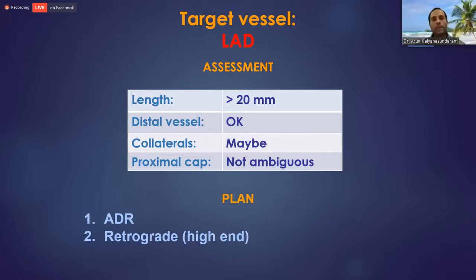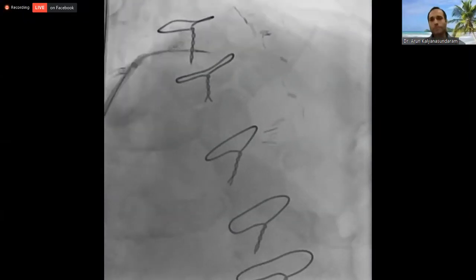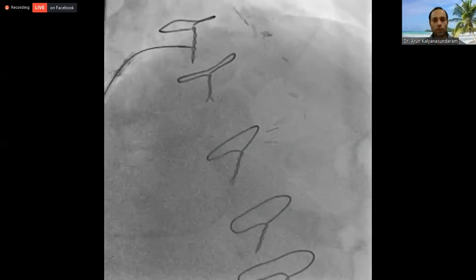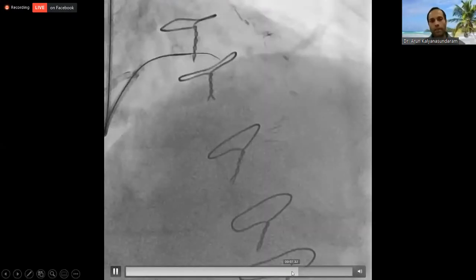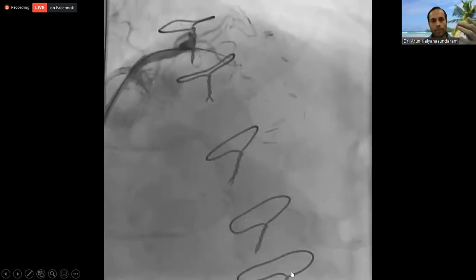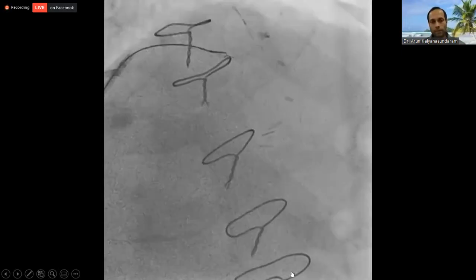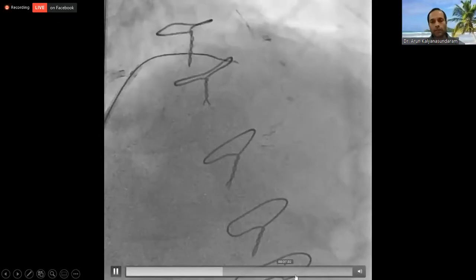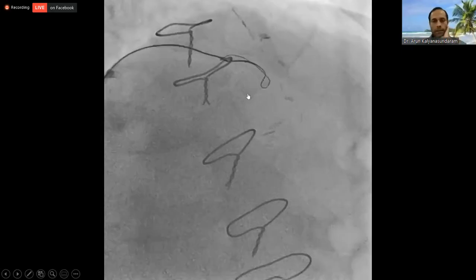So my plan really was to go do antegrade dissection reentry. That's a microcatheter followed by a wire initially to penetrate. Again, it's probably a Conquest Pro 12. Once it penetrated, the next step is for me to get the microcatheter to the tip of that. I'm just going to skip through this a little bit. Then exchange for an XT, which is often what I use for knuckling. There, that's a knuckle, knuckle, knuckle. Nothing elegant about it, but it works.